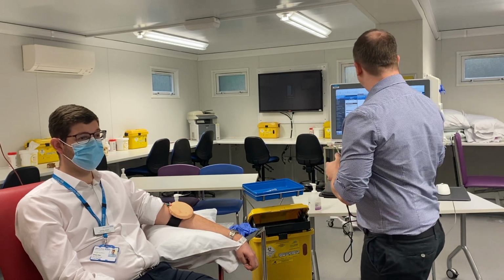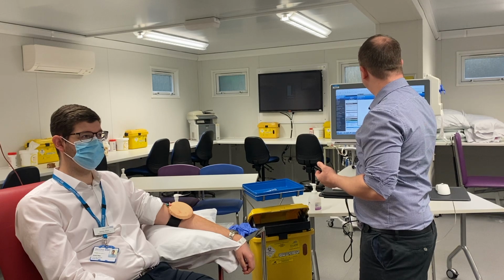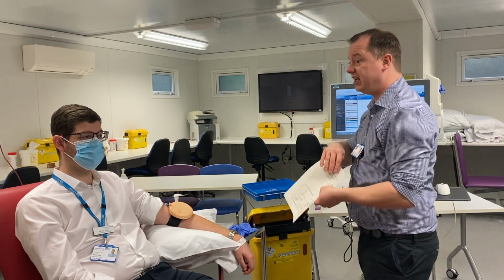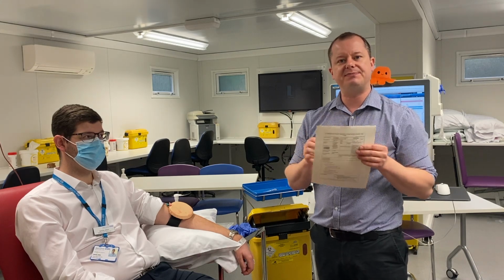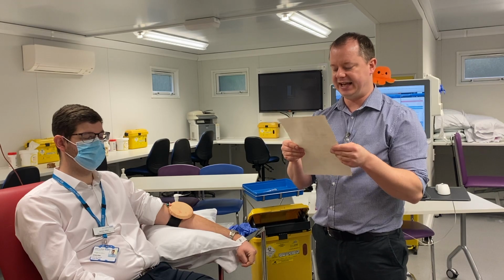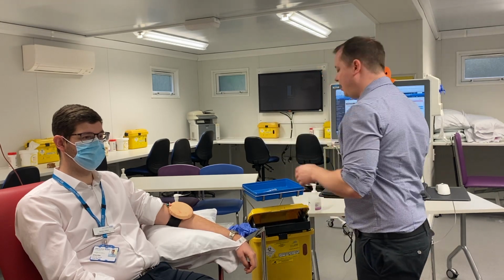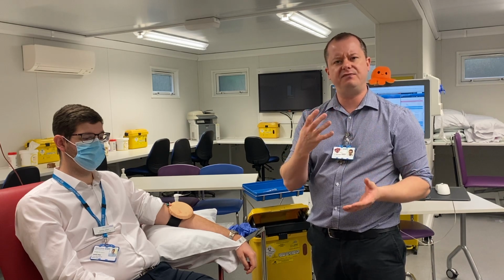Okay, brilliant. So I can then check that name and date of birth on the computer: SimDemo1, 1st January 1968. But because I'm taking a blood transfusion sample as well, I need to check that information on this paper form. So SimDemo1, 1st January 1968. That's brilliant. A verbal check isn't enough, we need to do a visual check as well.